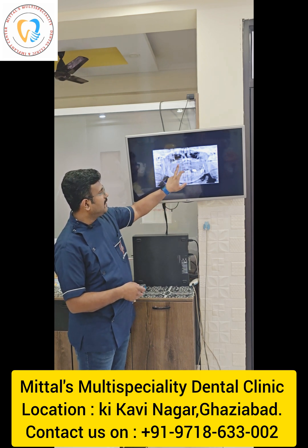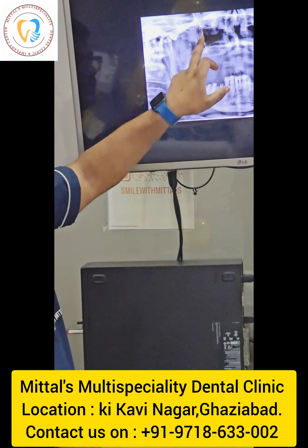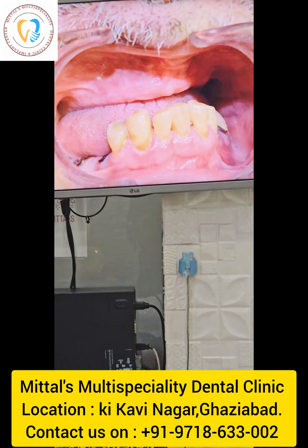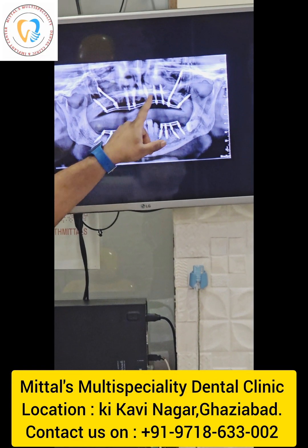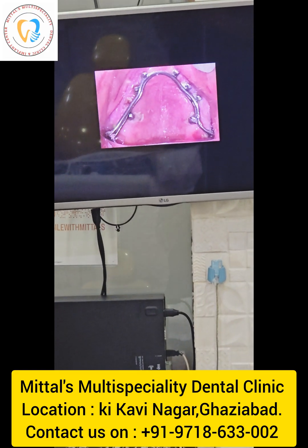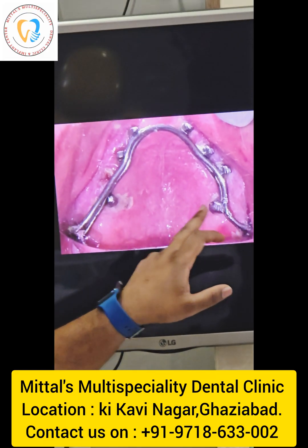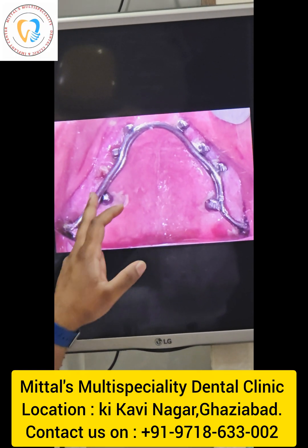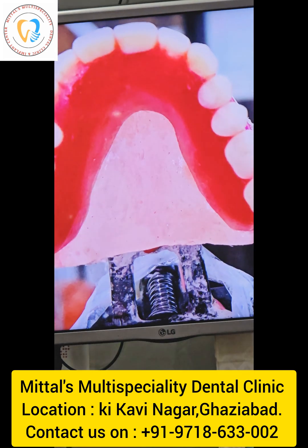So this is the entire area which has been pneumatized. This is your zygomatic bone, both sides we can engage. So this is how we placed it. Two zygomas, the rest are all basal implants. This is how the intraoral wiring looks. Transsinus flapless zygomas are always located on the palatal aspect. This is the mandibular double wire welding.